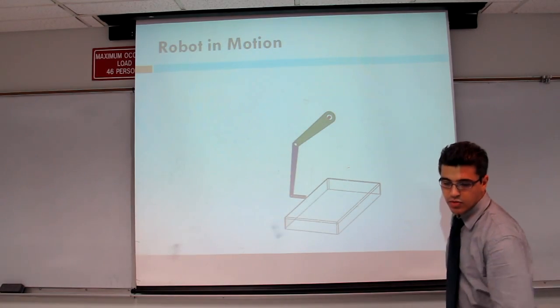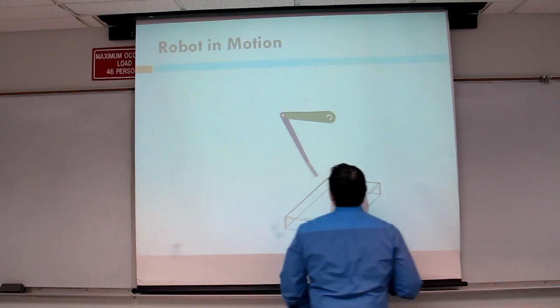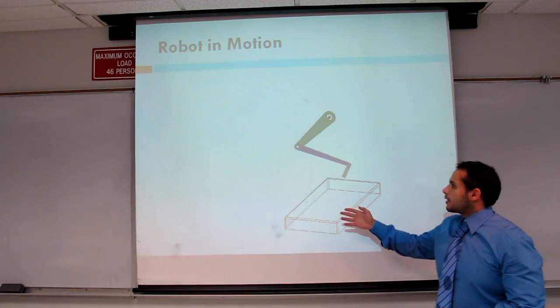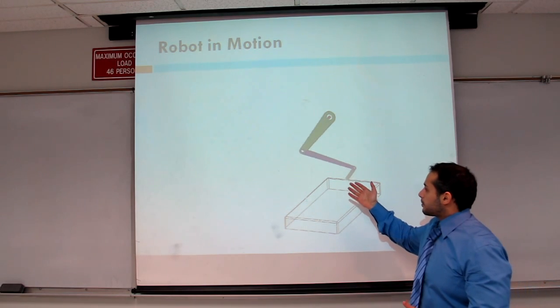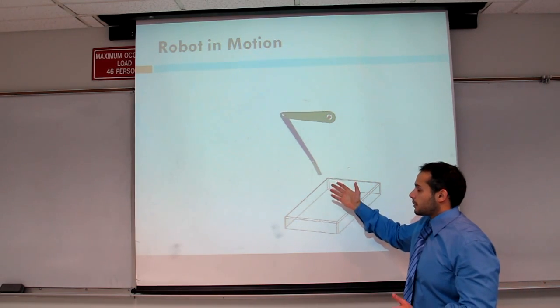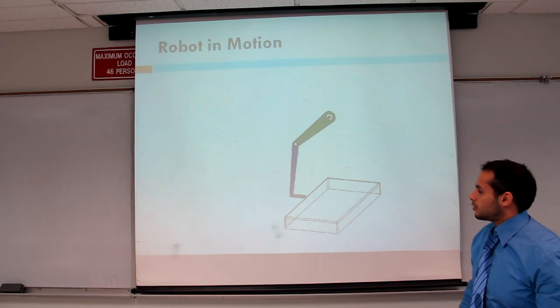Now Ghanem continues with the robot in motion. Now, as you can see, it's still in a semicircle path, and we can use such an application by plugging in through the manipulator a camera tool or an insertion tool.